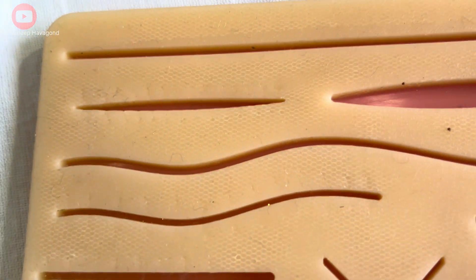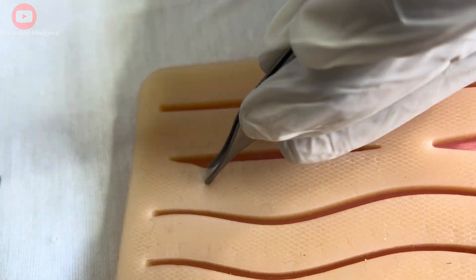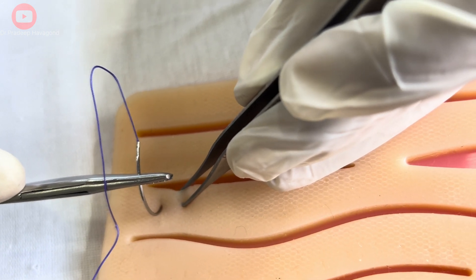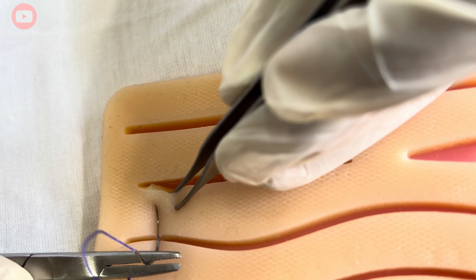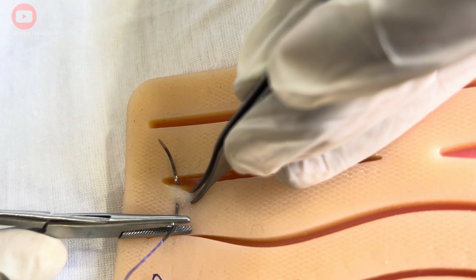In one hand, you have to hold the toothed forcep, and on the other hand, you have to hold the needle holder. Start by threading your needle through the tissue at a 90 degree angle. With the help of toothed forcep, raise a flap. The needle has to be inserted at 90 degrees.